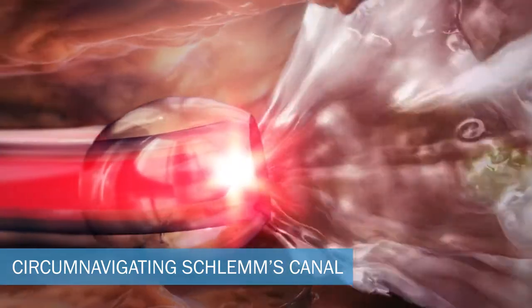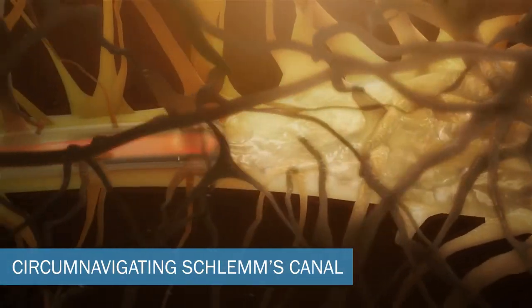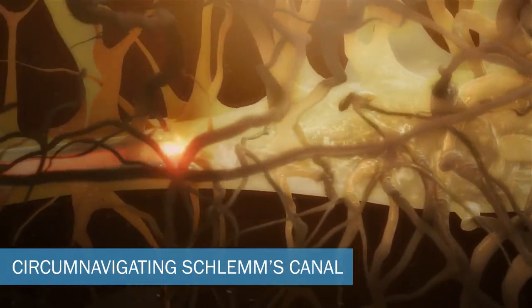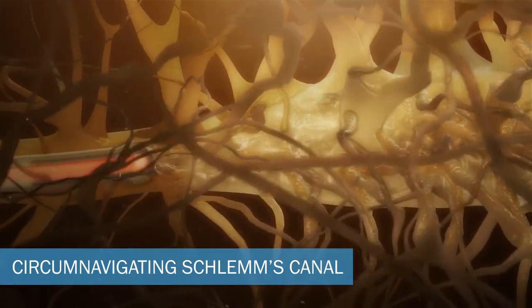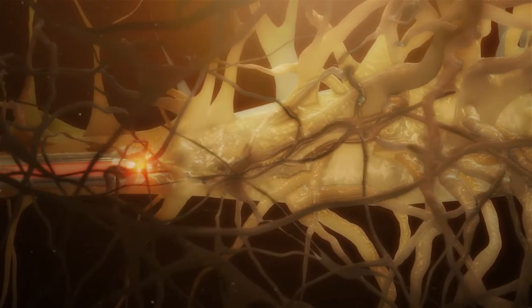This process of visco-dilation separates the compressed tissue planes of the meshwork and triggers the withdrawal of herniated inner wall tissue from the collector channels. It also dilates and flushes the newly opened collector channels.